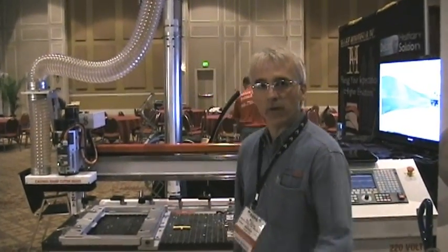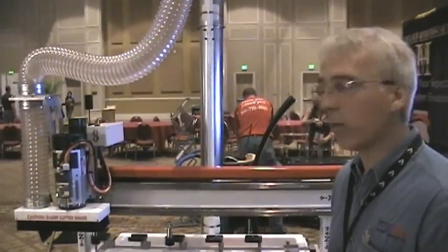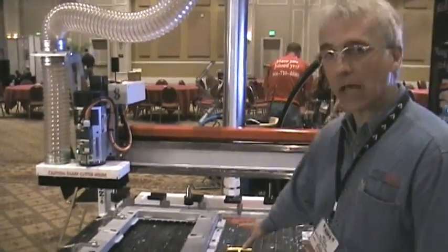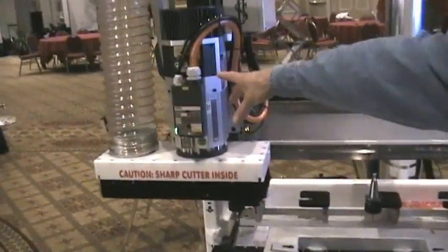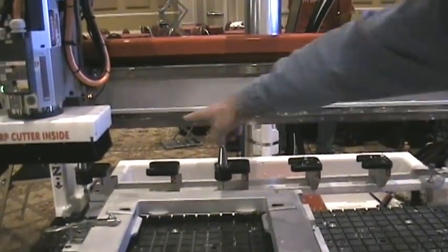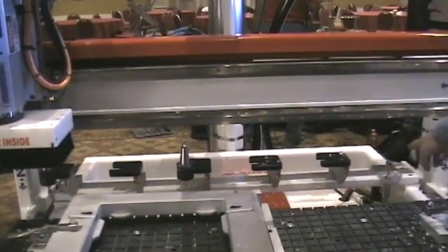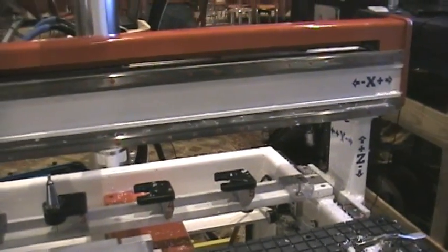Let's talk about the machine tool. This is a Patriot OrthoRoute 4x2, so it's got a 4x2 foot table. We've got a 5 horsepower automatic tool change spindle, so we can pick from a selection of tools automatically. This has a 5-position tool rack so we can pick from 5 tools, and it also has an auto tool height sensor for setting our Z0s.